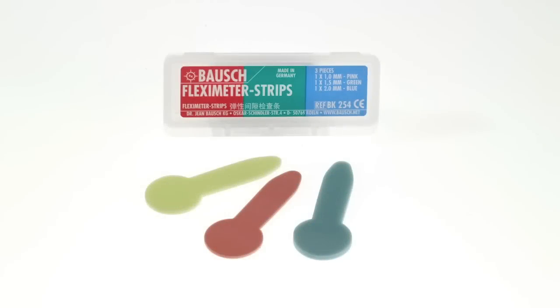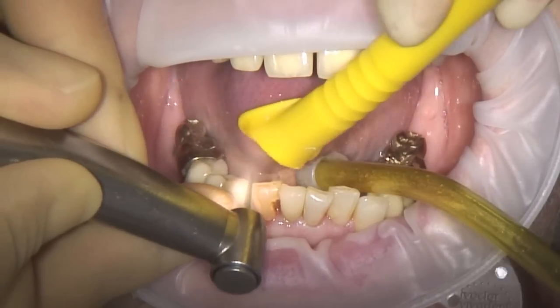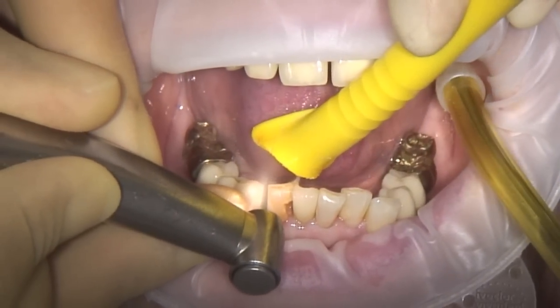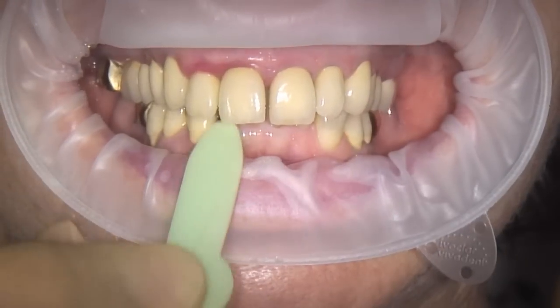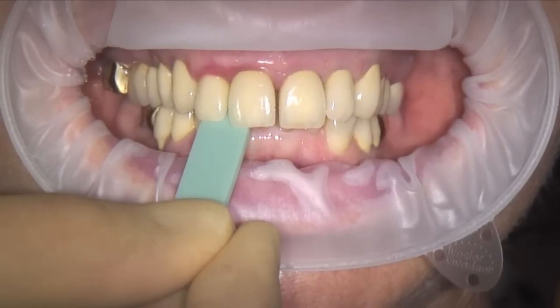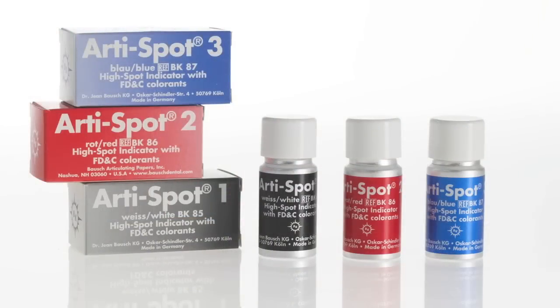Fleximeter strips are a useful innovation for the dentist and technician alike. These strips are flexible measuring instruments in three different thicknesses. They measure the height of the preparation on grinding teeth for restoration, for example crowns, bridges or telescopic crowns.